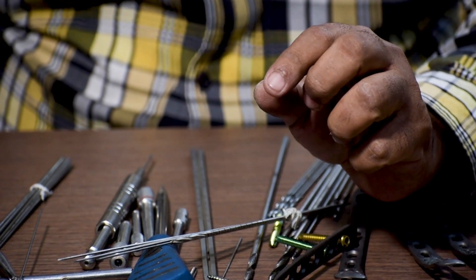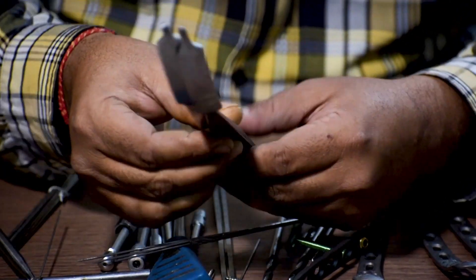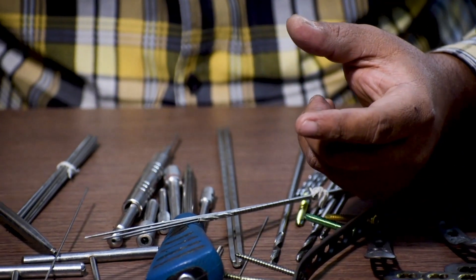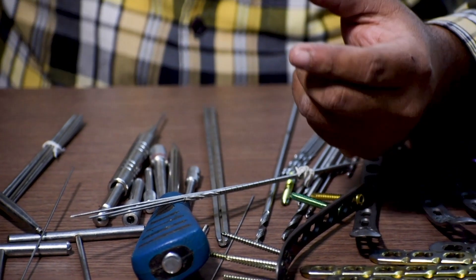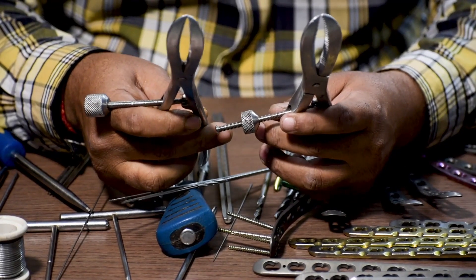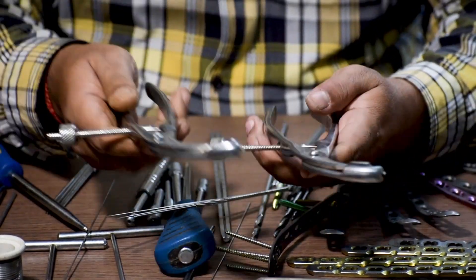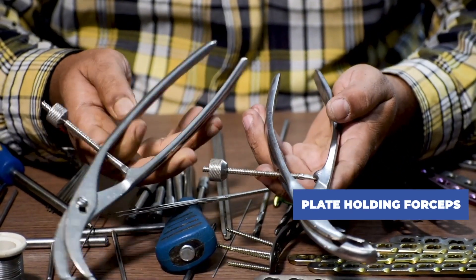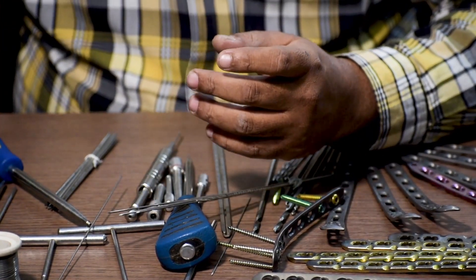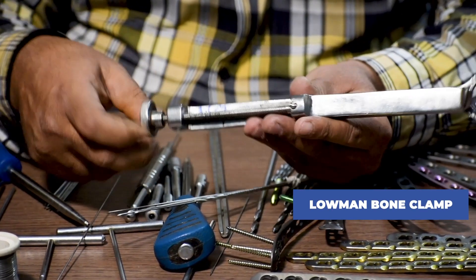In order to fix a distal tibia fracture, we will also require a few general instruments. First, we will need a Hohmann retractor, also known as a bone lever. Then there is a reduction forceps, which helps in reduction. Next is a plate holding forceps, which holds the plate and the bone together. Sometimes we use a Lowman's clamp, which helps in holding the plate with the bone.